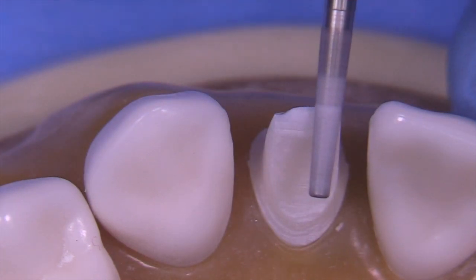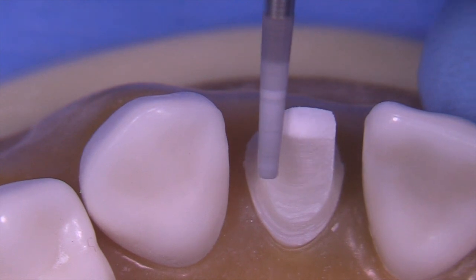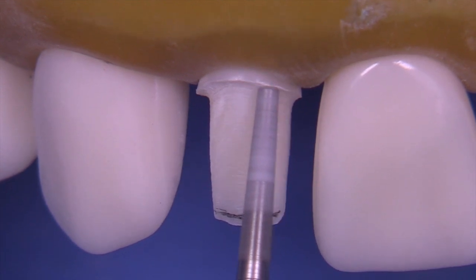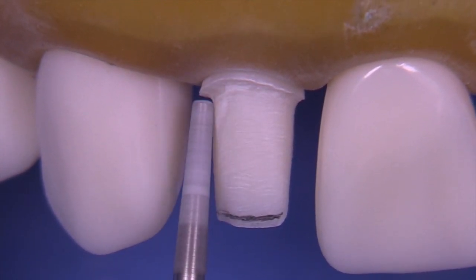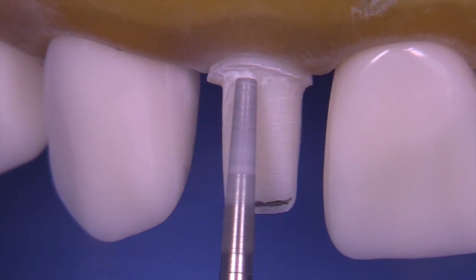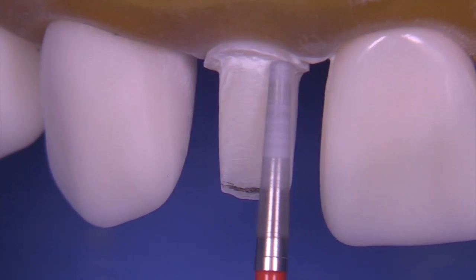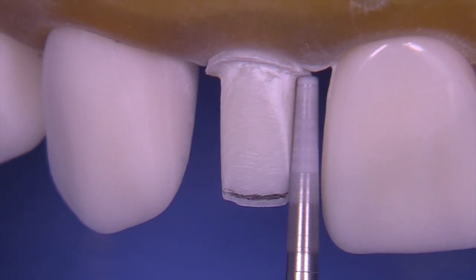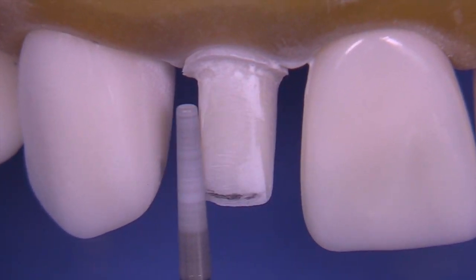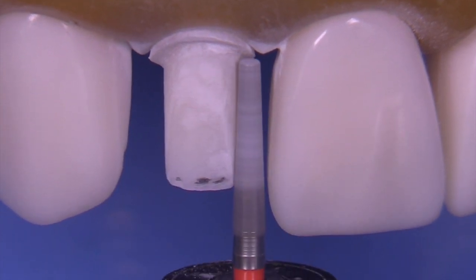We can continue to reduce on the incisal. At this point the incisal edge has become an actual edge rather than a flat area, so while we're reducing we can angle the bur a little bit to get a little more lingual clearance at the same time. The tip of the bur can be used to gauge how wide the shoulder is. We're using the red stripe diamond at this point because it provides a smoother finish, which is desirable.